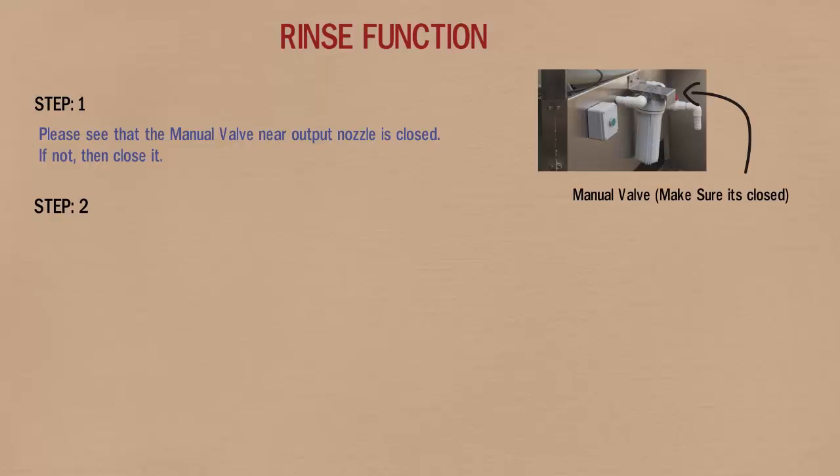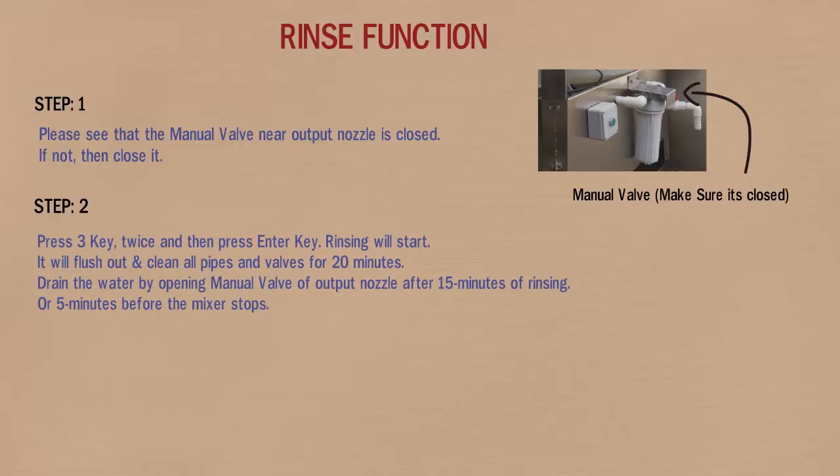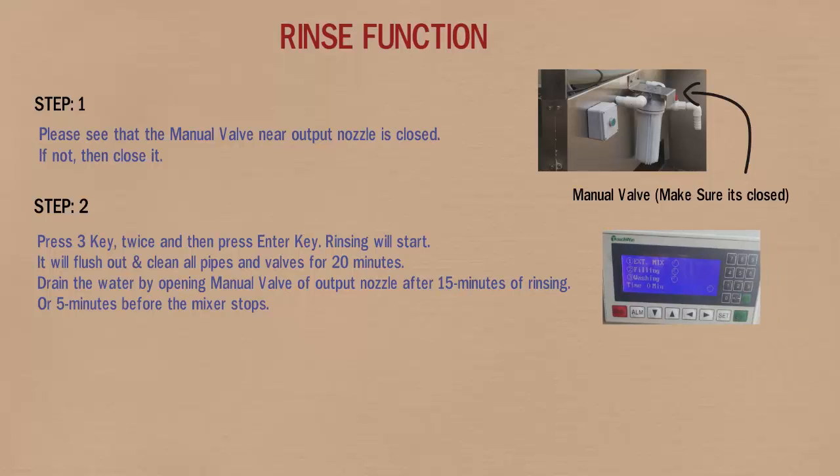In step 2, press 3 twice and then press ENTER. Rinsing will start — it will flush out and clean all pipes and valves for 20 minutes.